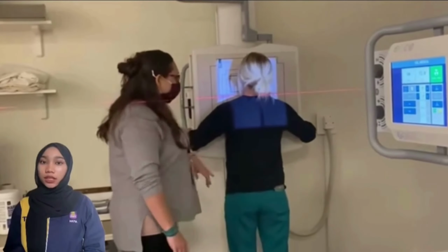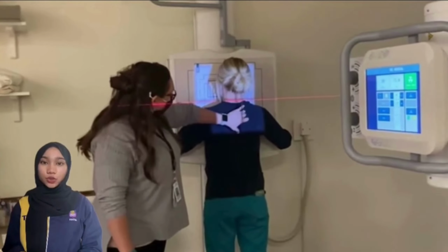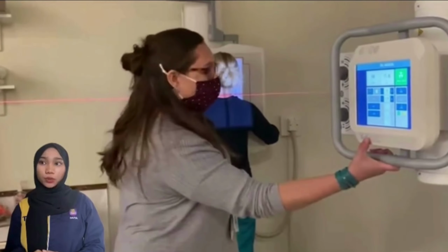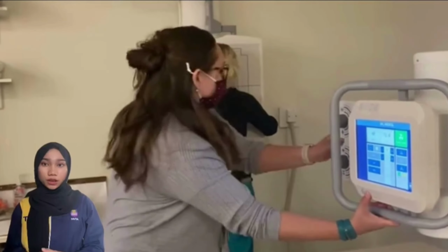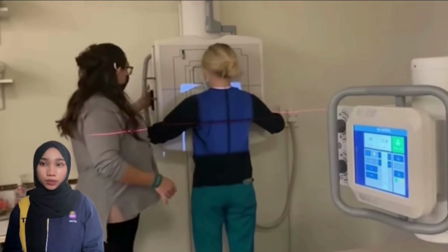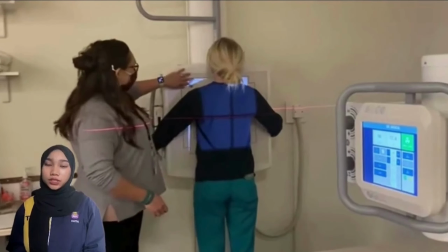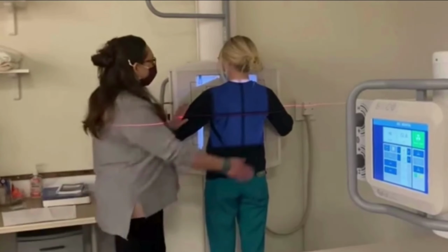The second challenge is that it requires technologists with proper training and adherence to protocol. This is crucial for obtaining accurate images and reducing errors. This is because balancing the need for high-quality images with minimizing radiation exposure can be quite challenging. Therefore, it really requires skill and experience.